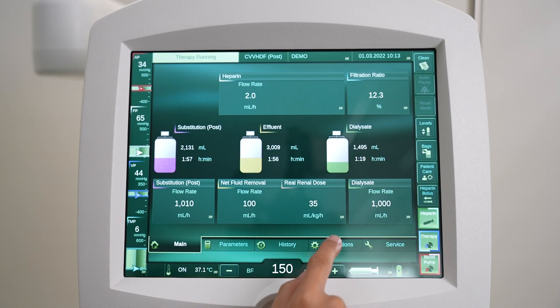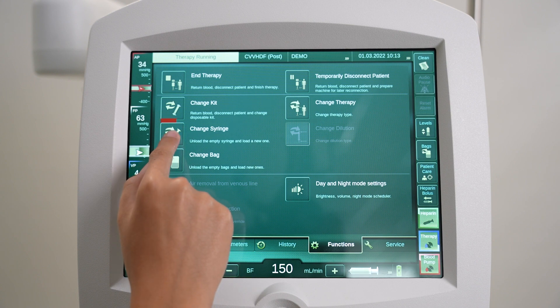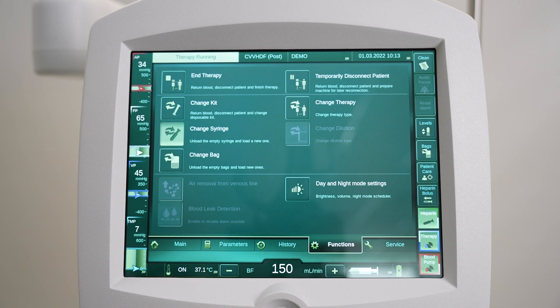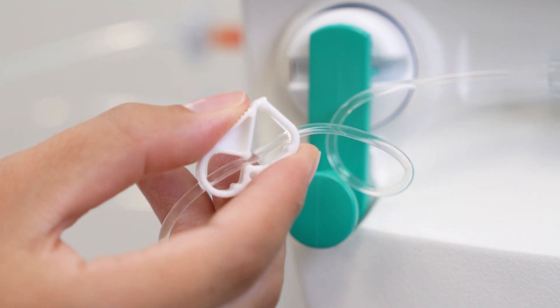Press Function on the menu bar, then press the Change Syringe icon. The syringe change screen pops up. Simultaneously, the syringe pump is stopped while the blood pump and fluid side pumps continue running. Close the clamp on the heparin line.